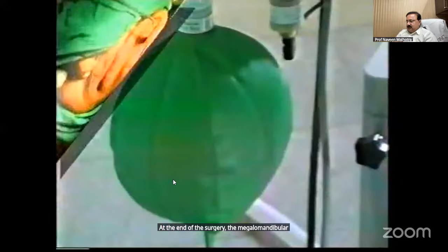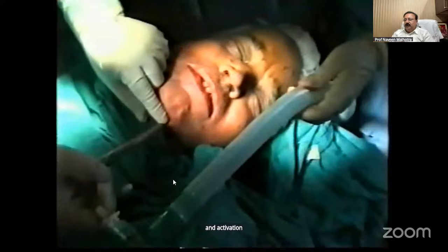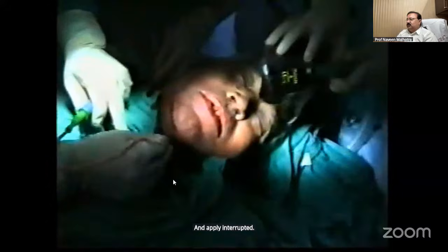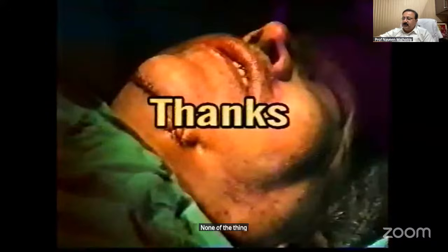At the end of the surgery, the maxillomandibular fixation is removed, sutures are cut, and you can do thorough orotracheal suctioning and extubation through the submental tunnel and apply interrupted 1-0 or 2-0 silk sutures. And this we do ourselves. None of this is done by the surgeons.